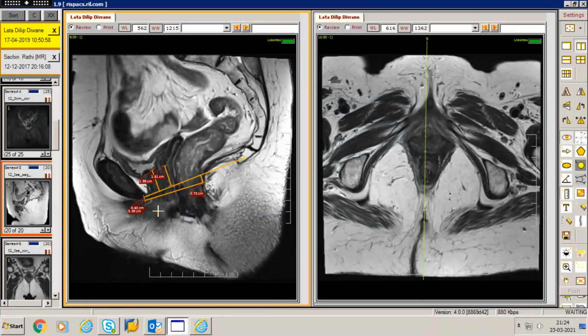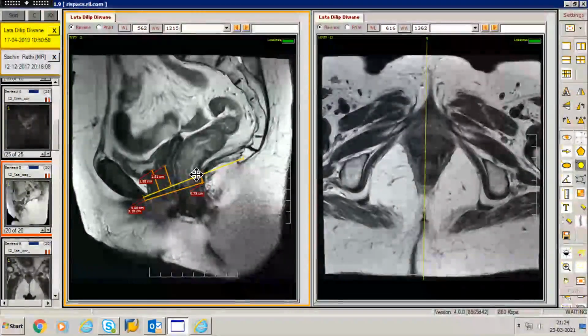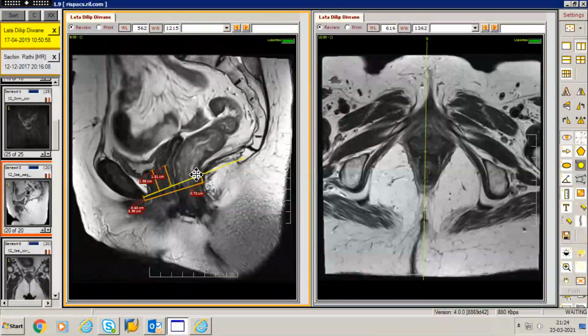So these are the initial lines. Just to get to, yes, sir? What you need to tell them also is what the two lines, especially the PCL and the H line, typically mean in terms of anatomical structures, in terms of what is the hiatus and what is the descent by the PCL?